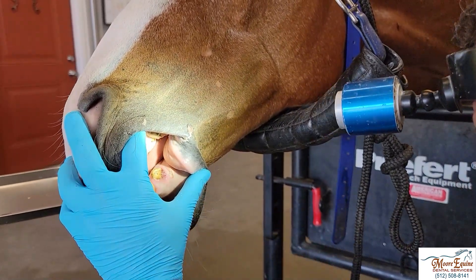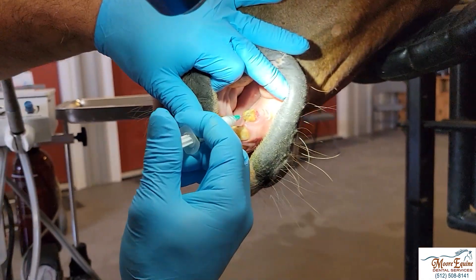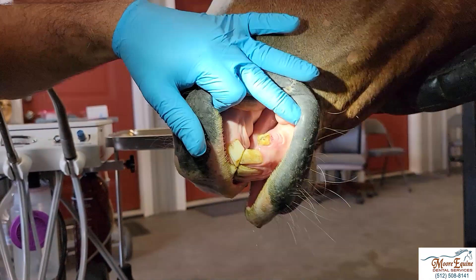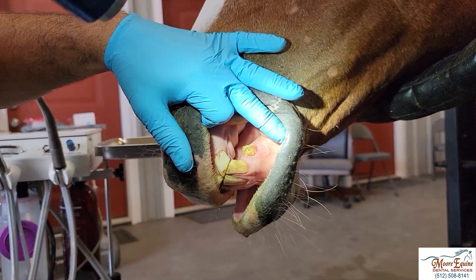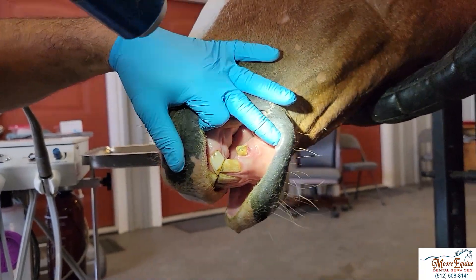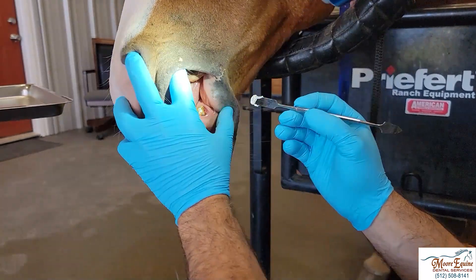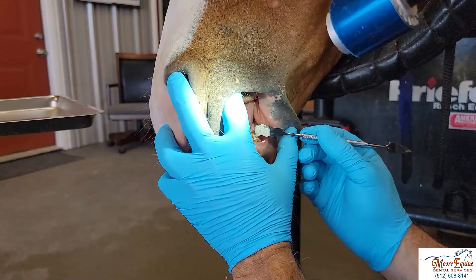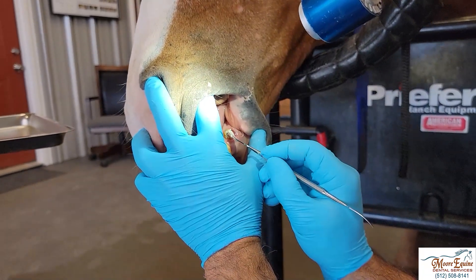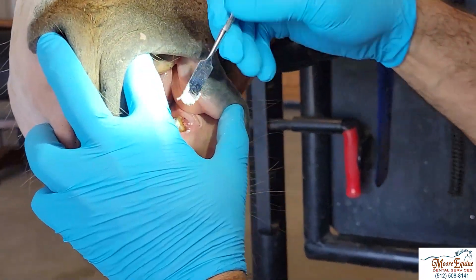Here we're putting in a little bit of calcium hydroxide paste down low. That's going to help the pulp to regenerate some odontoblasts, form a dentine bridge, and it's also a little bit antibacterial. There are a lot of different materials you can use, but on a canine it's not in wear.